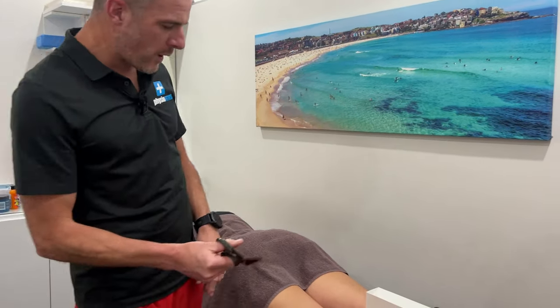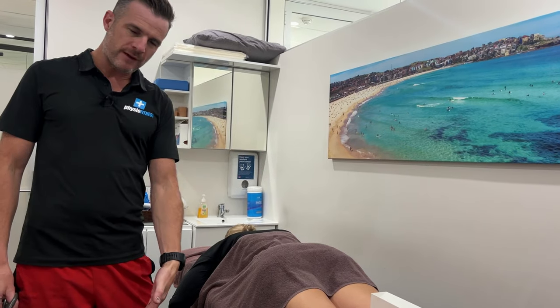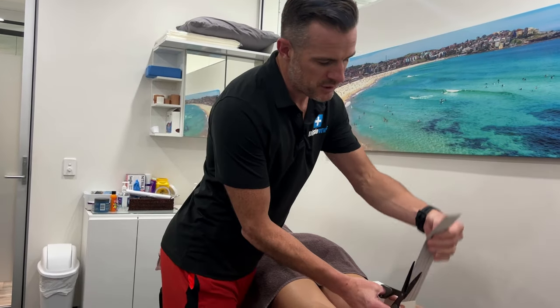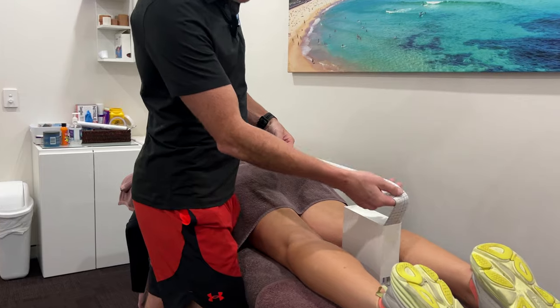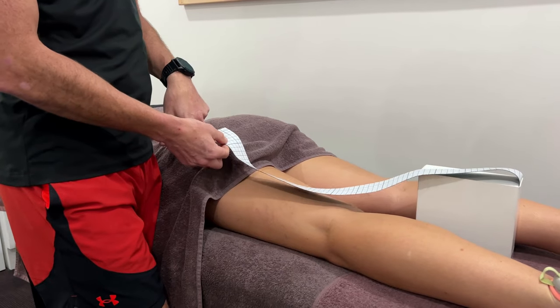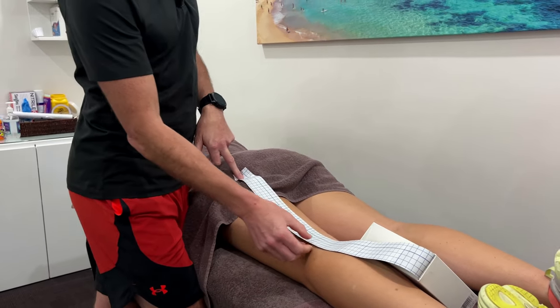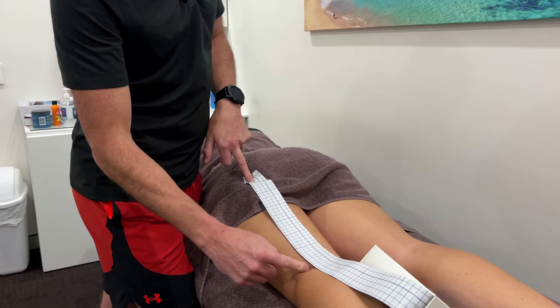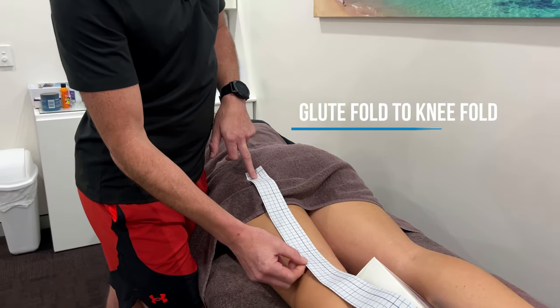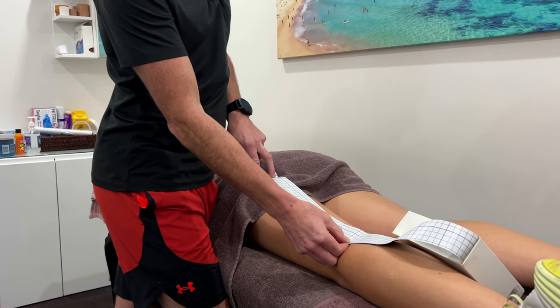With kinesio taping, what I would do is measure what you're doing first before you put them in position, because you're going to have to get them on a bed with their leg off. It's quite hard sometimes at games — you usually have to have a table — but we need that hamstring on stretch. Measure how long you need, because you want to get the hamstring taping exactly the right distance. You're going to tape from above the ischial tuberosity, sort of up at the glute, to the bottom of the hamstring. Because you're stretching it, you don't want the full length — only go to about the knee fold. That's how long you want to tape, because when you stretch it, it's going to go longer onto the attachment.